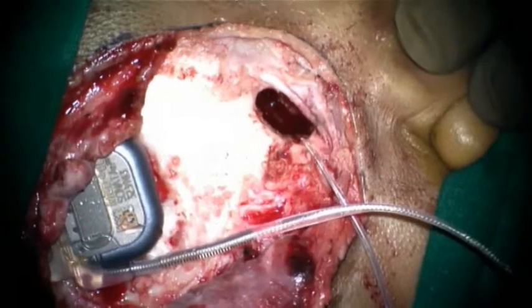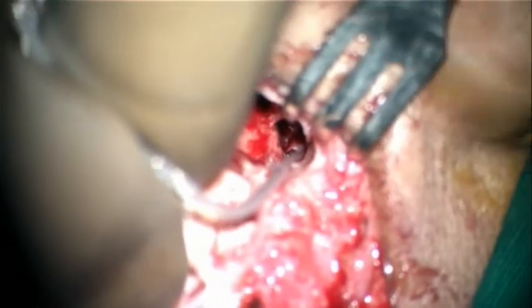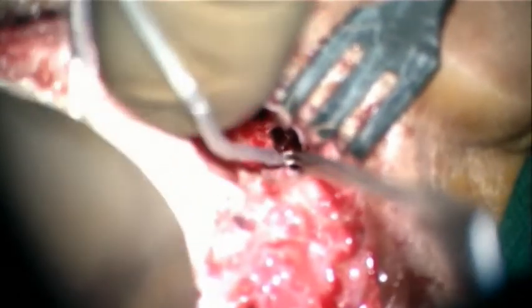The cochlear implant is now inserted — this is a Sonata Opus 2 from MED-EL. The actual device is inserted into the cochlea all the way up to the marker ring.